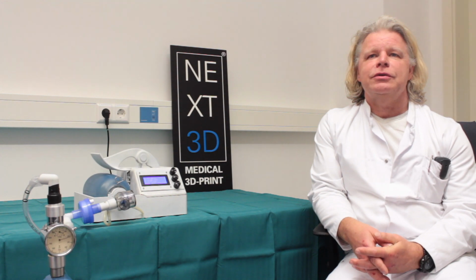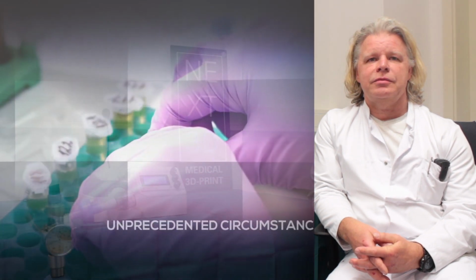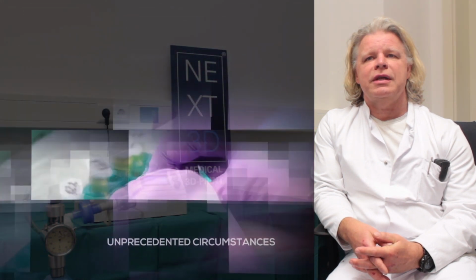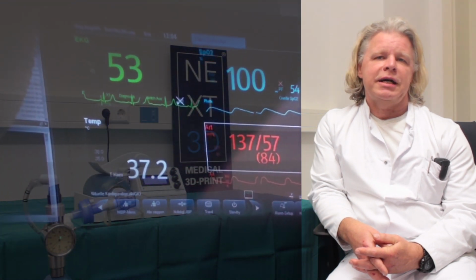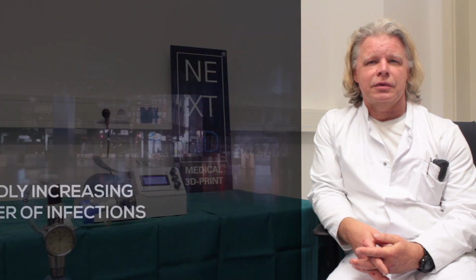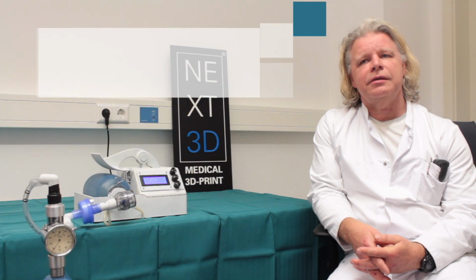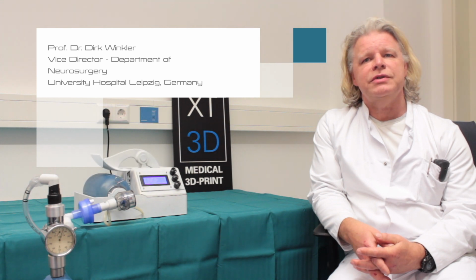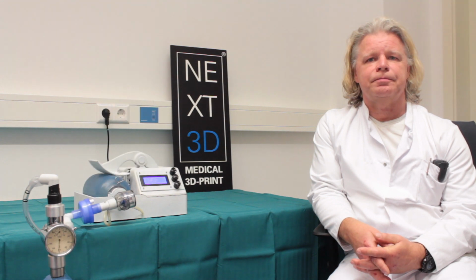Corona is an opportunity to look at new ways and to provide new forms of treatment in an emergency and for a large number of patients. Severe courses of this lung infection are characterized by failure of breathing and oxygen saturation in the blood. If left untreated, this condition leads to death. One of the basic treatment alternatives is mechanical ventilation to compensate for this failure of the gas exchange.